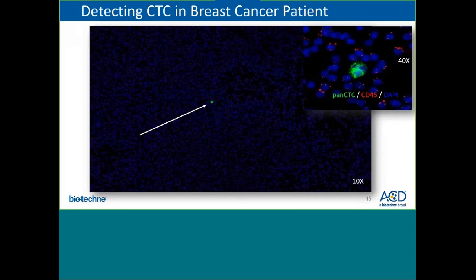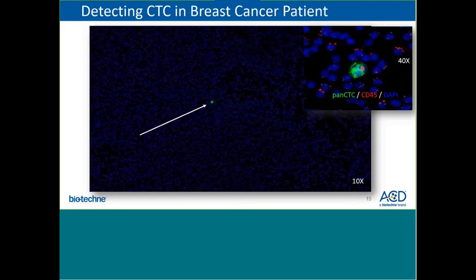Whereas the last two examples employed chromogenic RNAscope, this image is an example of a multiplex fluorescent assay using two channels. This sample is peripheral blood from a breast cancer patient stained with pancytokeratin and CD45. The CD45 RNA molecules in the white blood cells appear as red dots, while the cells with green signal are circulating tumor cells with high expression of pancytokeratin. At low power you can see the single CTC in this pool of peripheral blood cells, and at higher power you can see the high level of pancytokeratin expression for this CTC in the context of peripheral blood cells staining with CD45, with DAPI showing the nuclei of all nucleated cells.